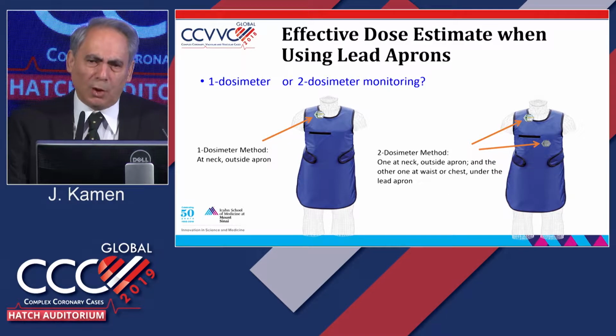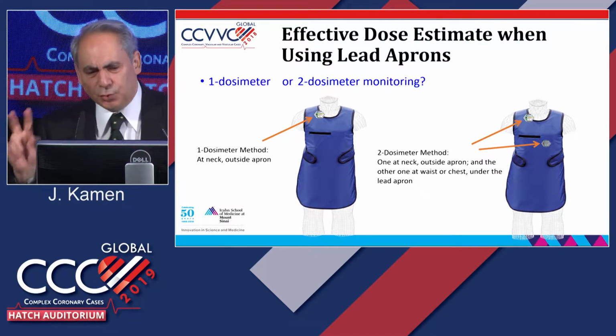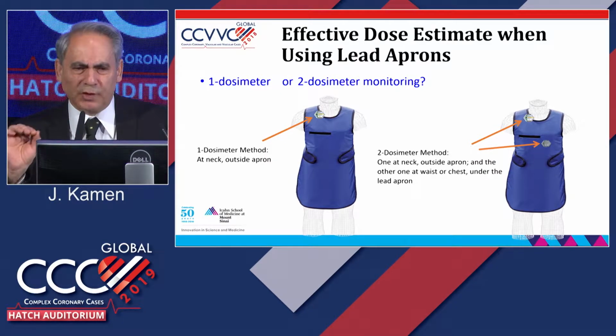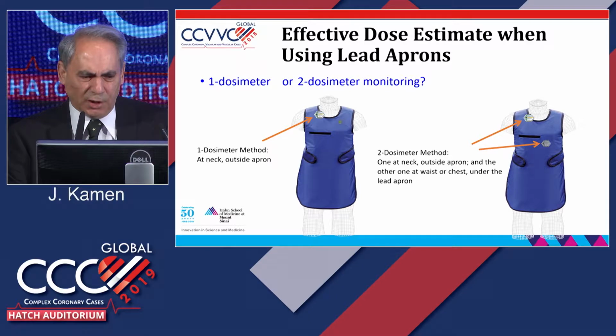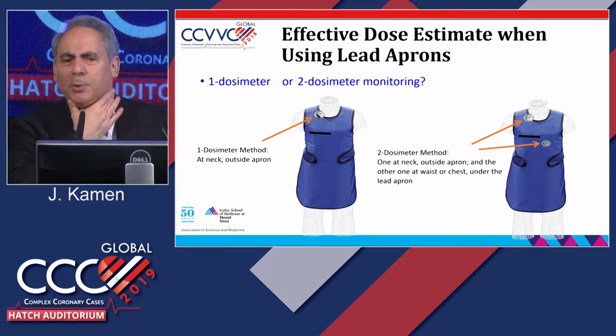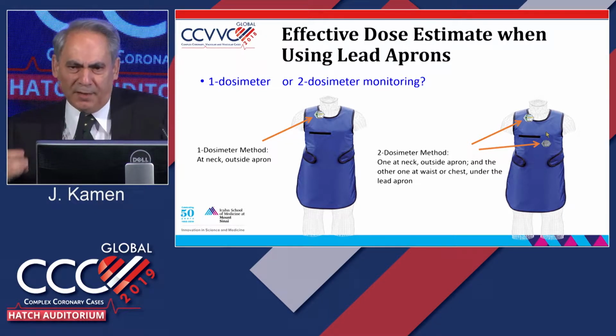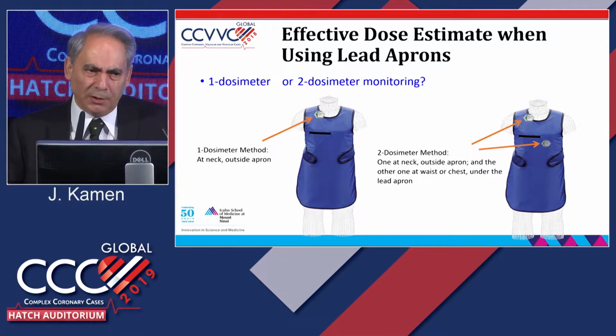There are two methods of effective dose calculation. In some institutions, they give you one badge outside the apron around your neck. In some institutions, they give you two badges, one outside the apron, one under the apron. And they calculate from either of these two situations what your effective dose should be.